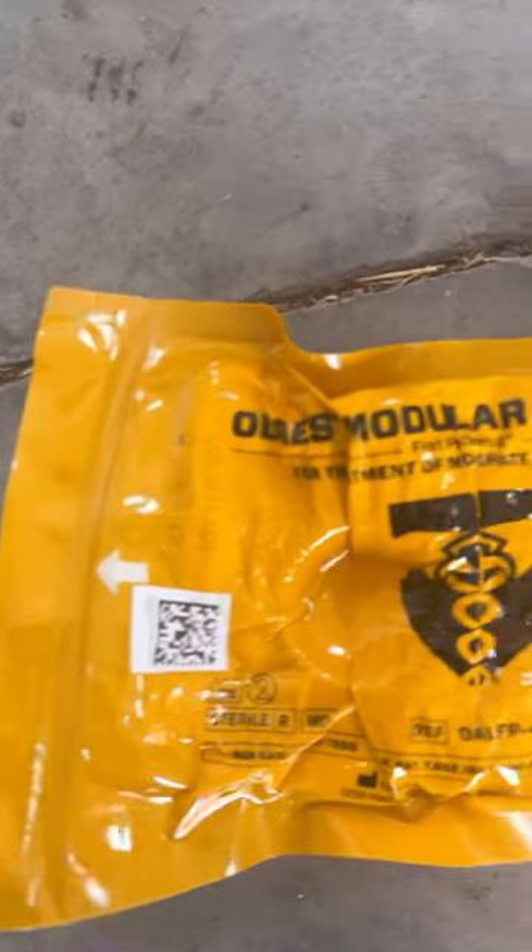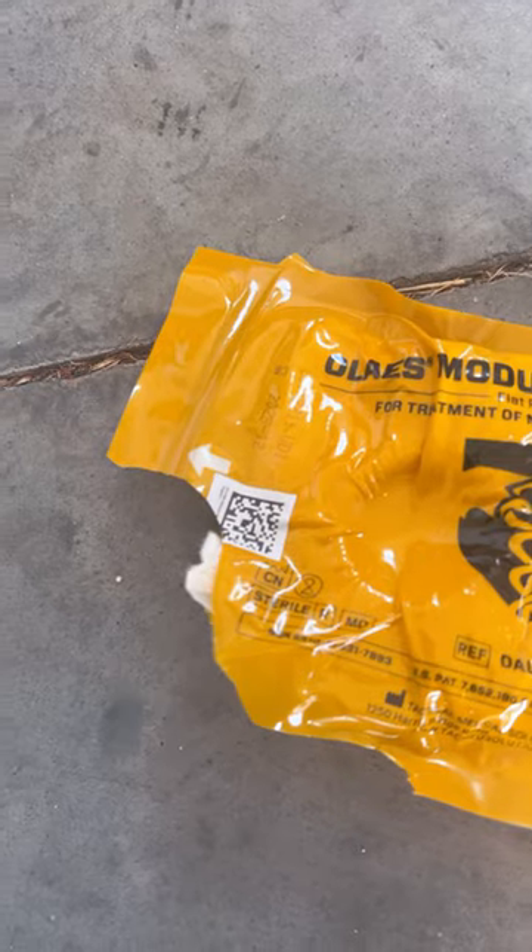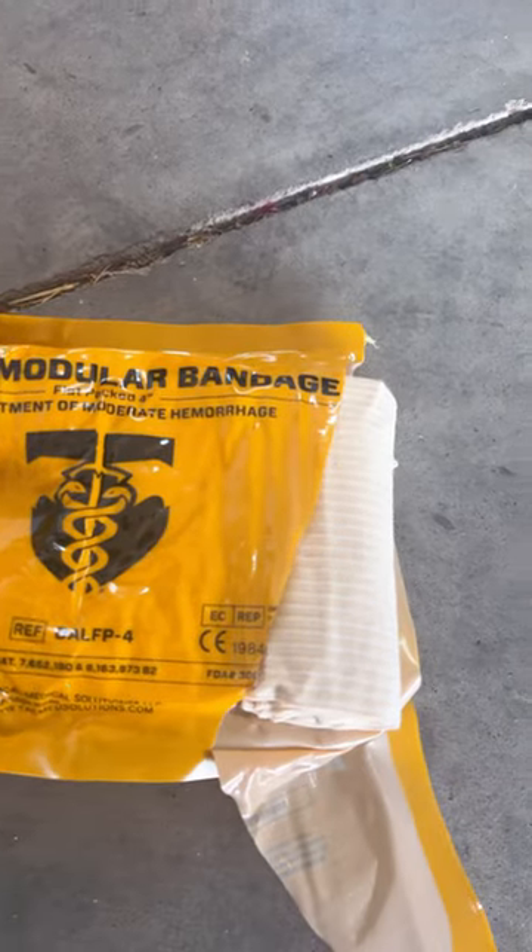We have a few different tear points to open the package up — opens from there, opens from there.